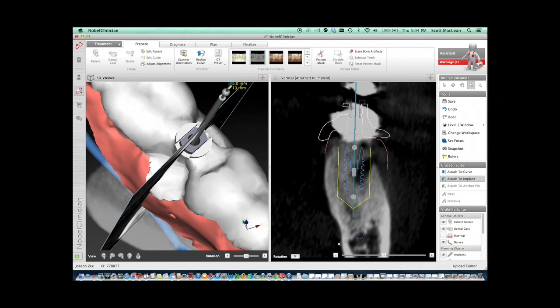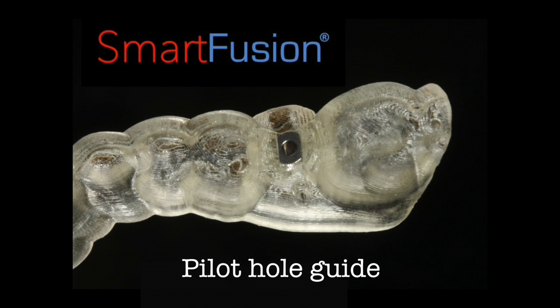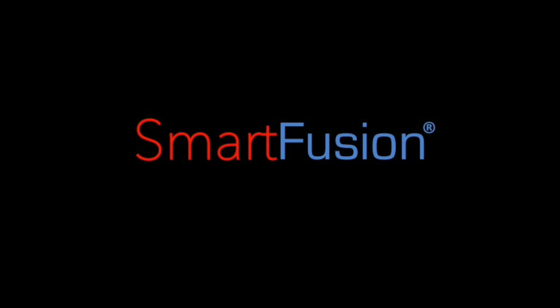After the guide is designed in Nobel Clinician, you can push a button in the software and it will send it securely over a network through Nobel Connect to Nobel BioCare, where at the plant they are going to fabricate this Smart Fusion guide for you. They will put it in a box, send it back to you, and this will fit accurately on the model and accurately in the patient's mouth, showing you where the apex of the implant is going to be during surgery.